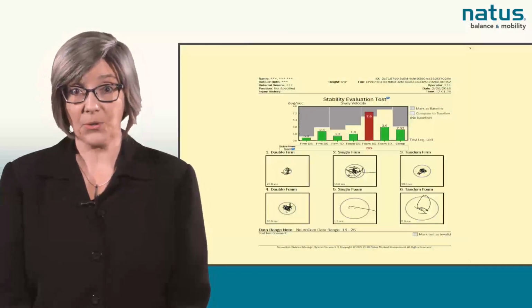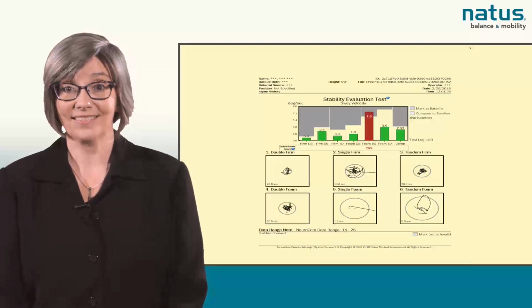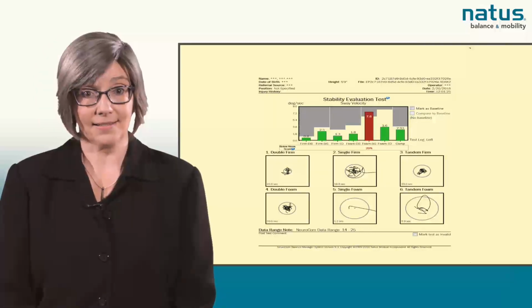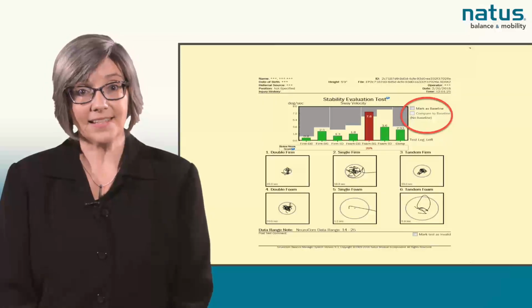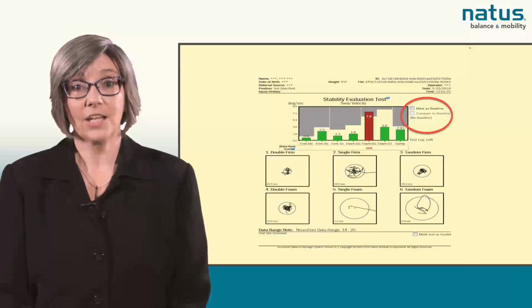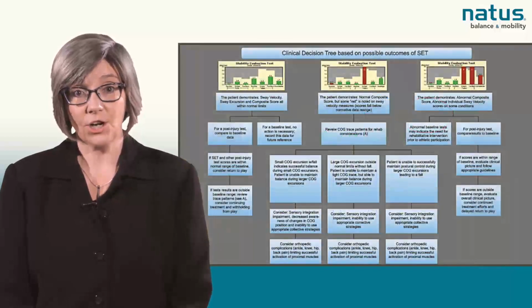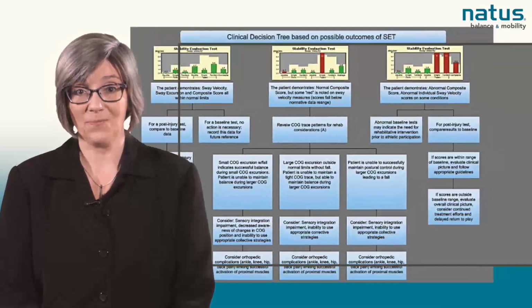After completing the full SET protocol, the clinician has the option to store the information as a baseline for the patient. On subsequent tests, clinicians can compare new results against stored baselines. Storing a test as a baseline test is as simple as selecting the box labeled "Mark as Baseline." This test will then be used as the one for comparison to future assessments. To compare a test to the designated baseline test, select the box Compare to Baseline. The chart shown displays possible care plans based on outcomes of the SET protocol.